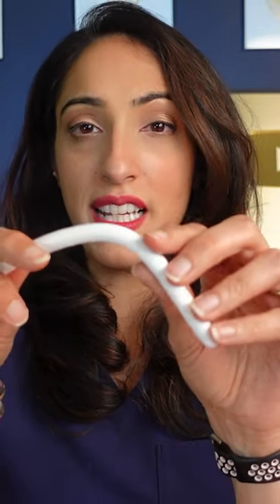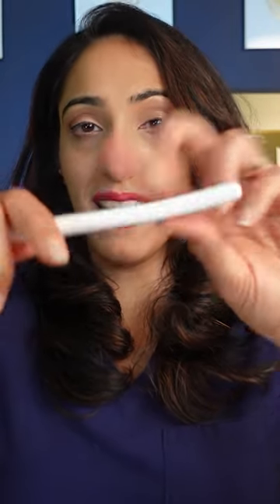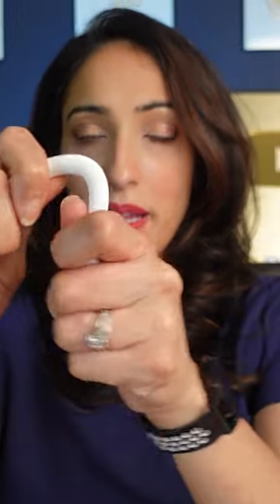They come in three different types. The first type is a semi-rigid device, which is a cylinder implanted into both sides of the penis. When you want to have sex you bend it up, and when you're done you bend it down, so you're always semi-erect.